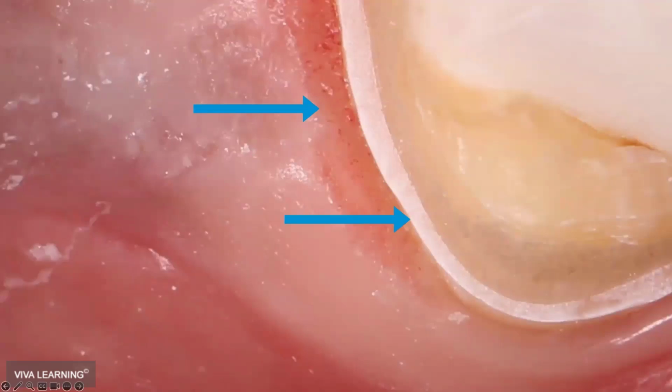It does stay bonded, but then what you can do is go in there and hit that bond with a handpiece and pop the sides off. So the joke that we have is instead of using 10 burs to cut a zirconia crown off, you only need half the life of one bur, right? So thanks, Chris, for that question.